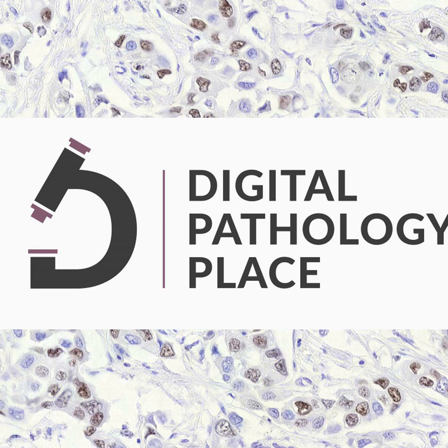They realized image quality artifacts, things like tissue folds, bubbles, out-of-focus areas, were tripping up the AI and confusing the pathologists. So they integrated an open-source tool called HistoQC. For quality control before the AI runs. Precisely. HistoQC automatically checks the slide image quality and can filter out or flag these problematic areas before they hit the H. pylori model. This improved the input quality. Smart. Did they do anything else?